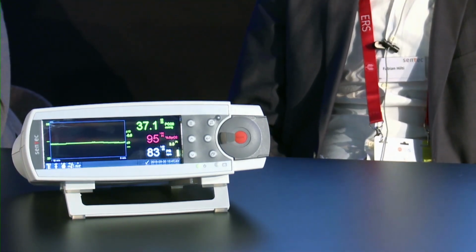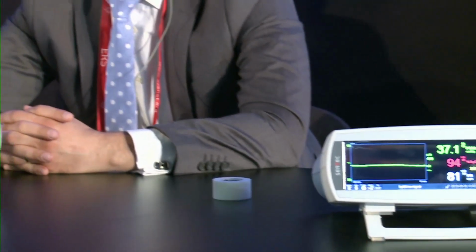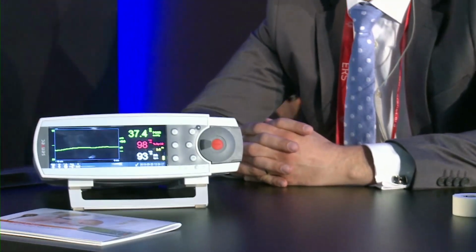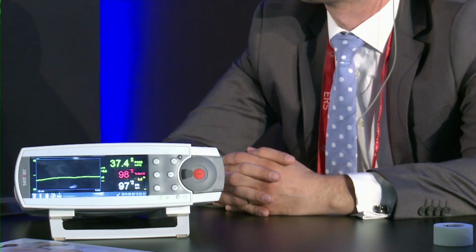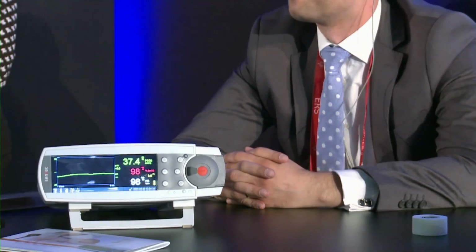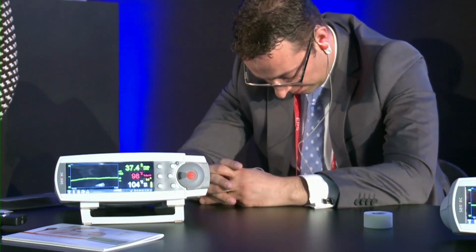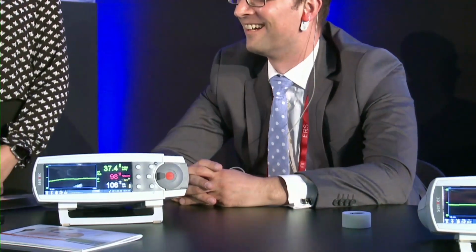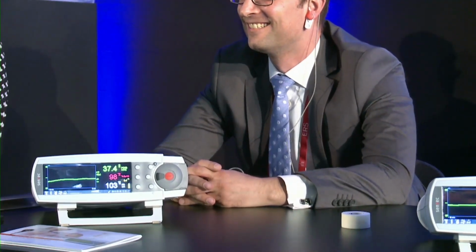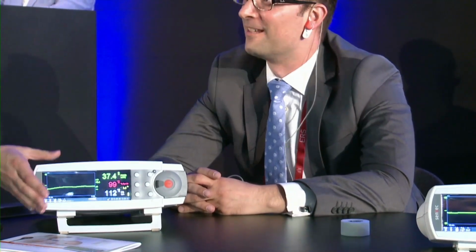Okay. If we switch over to Sorin, because what also happens in clinical practice is that patients are hyperventilating. We also would like to show you how fast that works. Sorin, could you please start hyperventilating? Sorin, just a second. I forgot something which is important, but no problem, we can continue. We can set a reference point on the monitor. So Chelsea will show us how to set the reference point.